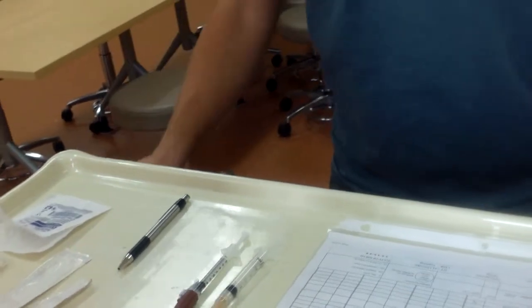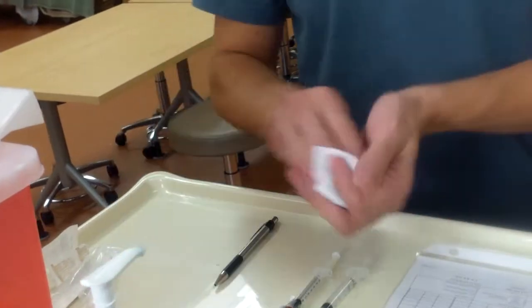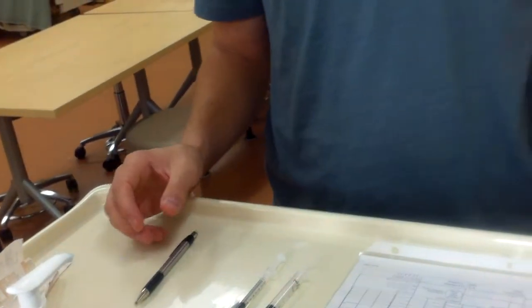So as my third and final check, I only need to do 2 of these. So then I'm going to lock this puppy up. So I have that. I'm going to clean up all of my supplies. All this is garbage. Okay. And then I am now ready to go to my patient's room.